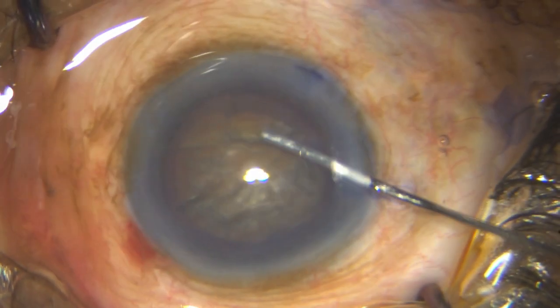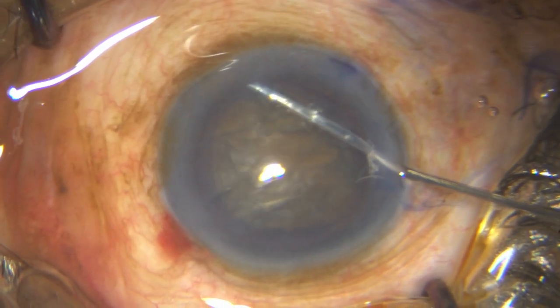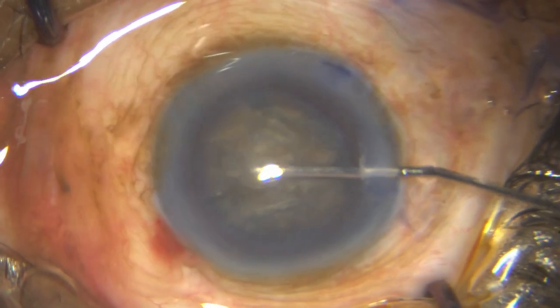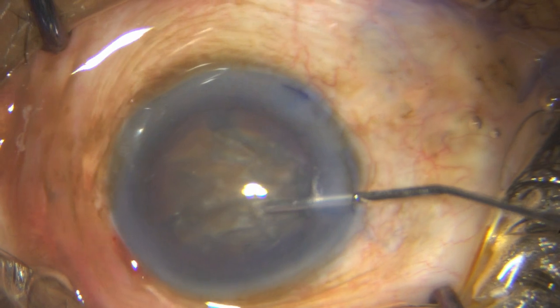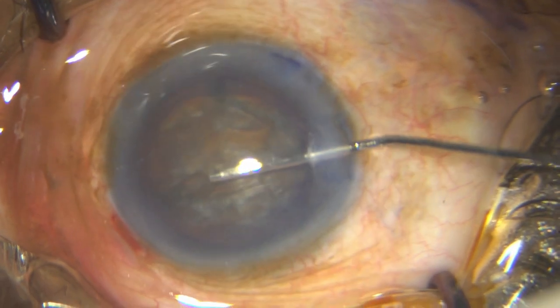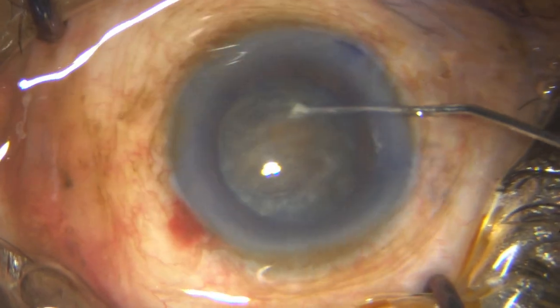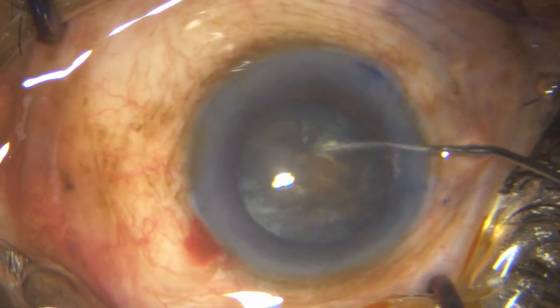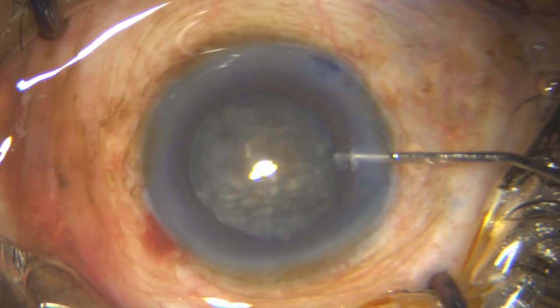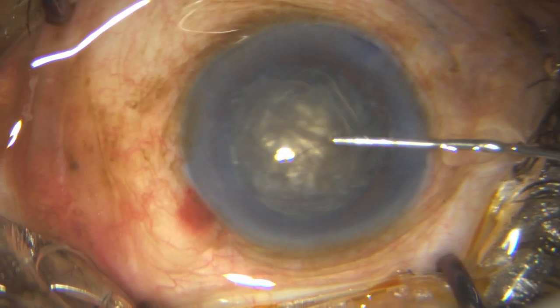Anyway, I have to work with what I have got. I go ahead to my hydrodissection, and the only indication you get here is forward movement of the nucleus. It is very important to get an adequate hydrodissection in a hard cataract — all the steps are extremely important, you cannot bypass and go to the next step; everything has to be perfect.